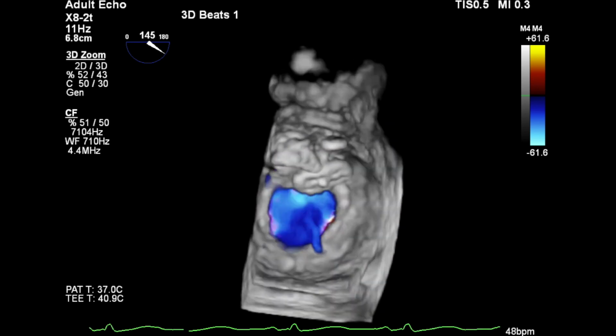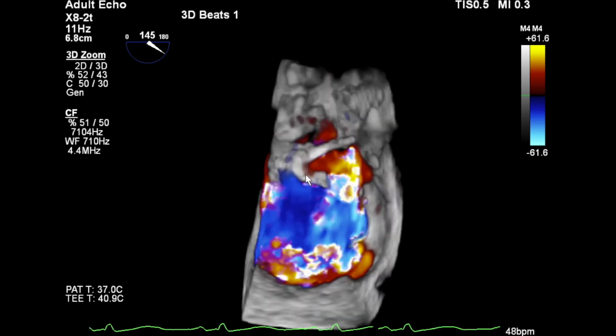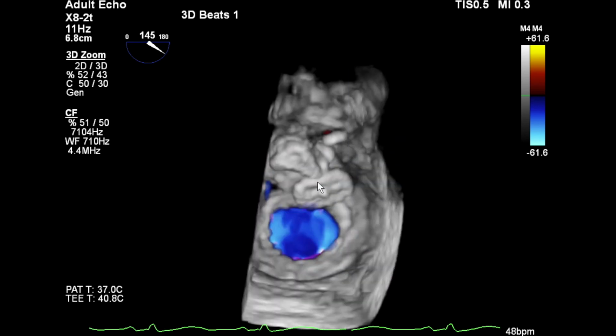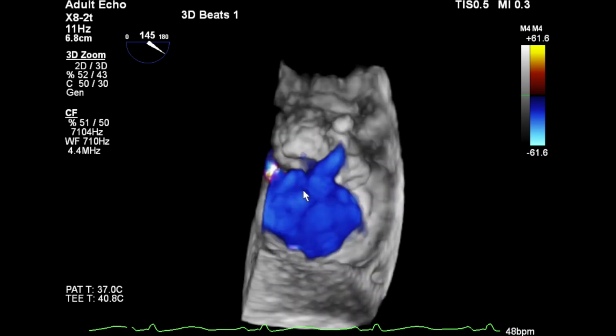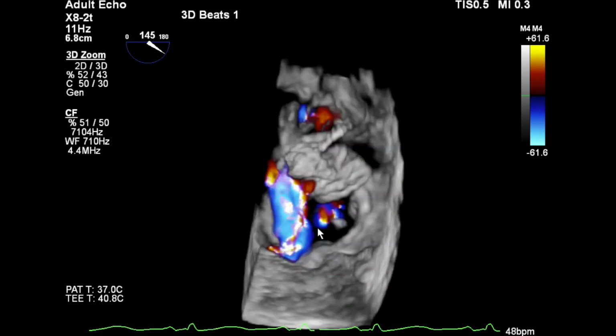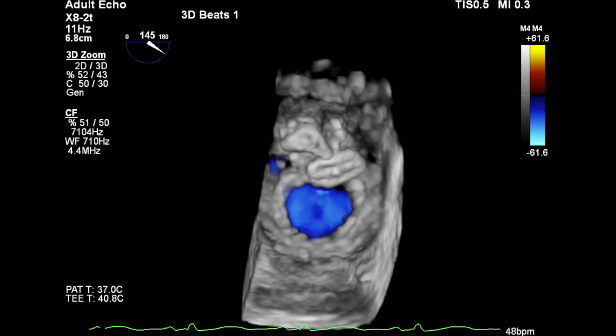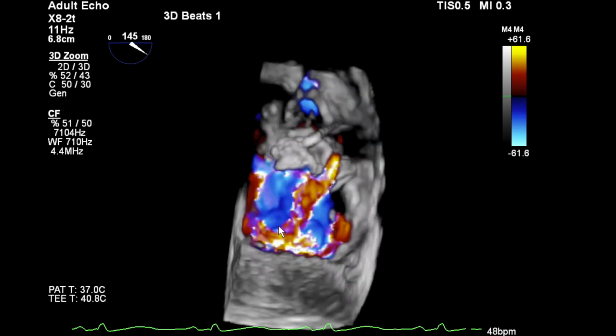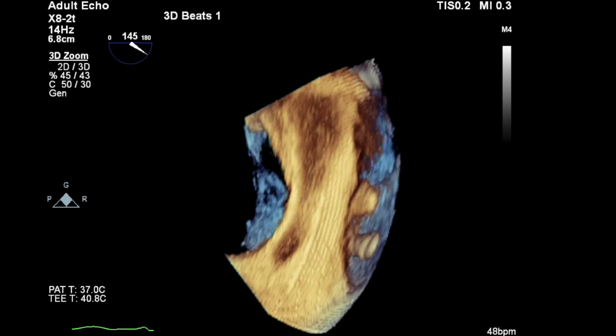So you're seeing the flow through the valve itself, but in fact that very large leak we were seeing on either side here and here has got significantly less just by even putting this here. So hoping that when you release this device that it will look better, and as it gradually shapes that it'll look better too. Okay, so let's do the LV side. Yep. So let me take the color off.